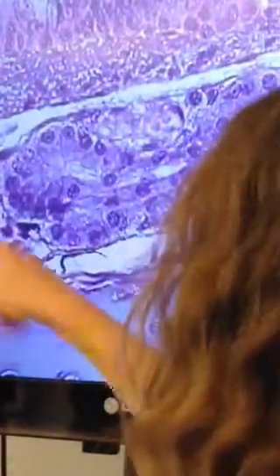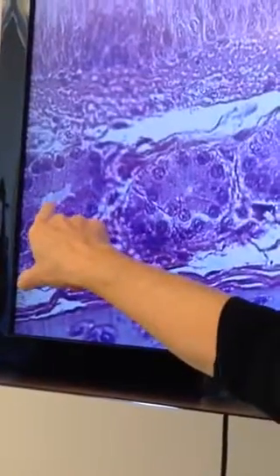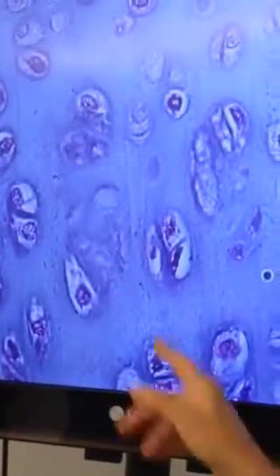These are the glands in higher power. So you know, they look like bagels or something. And then, so these are exocrine glands. That lumen would be going into the duct. Remember, exocrine glands have ducts. So, you know, sometimes if you look at enough slides, you probably would see a duct going up through there into the lumen. And then there's the classic cartilage with the chondrocytes and lacunae, and this is hyaline cartilage. So the background looks sort of glassy, smooth, although really there's a lot of collagen in there.